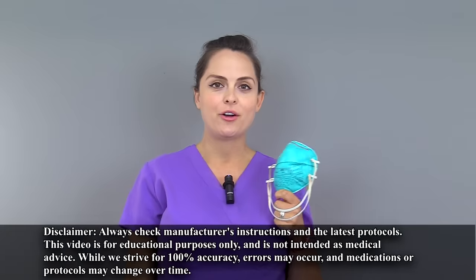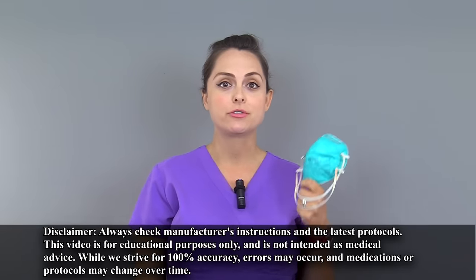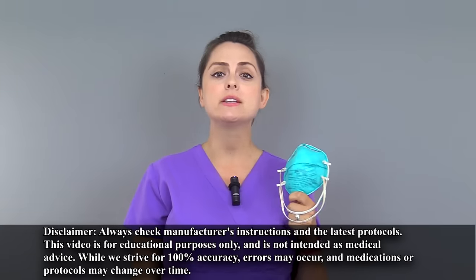Before donning or putting on an N95 respirator, you always want to follow the manufacturer's instructions. Also, you want to follow your facility's protocol for getting fitted for your N95 respirator. This is usually done yearly, but it can vary.